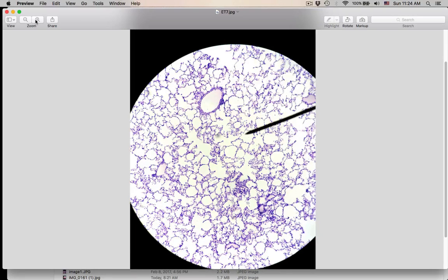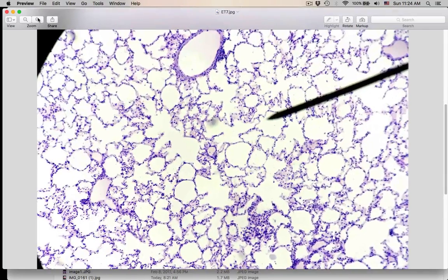And the function in this organ of this epithelial tissue where the pointer is in the lumen. What is the function? So this is still part of 15. That was number 15.